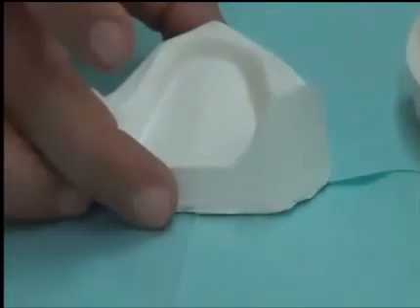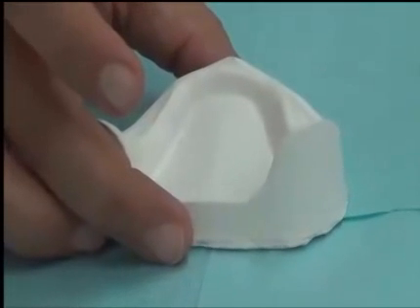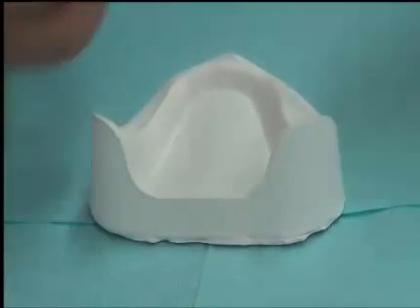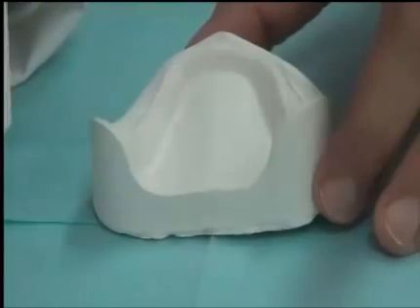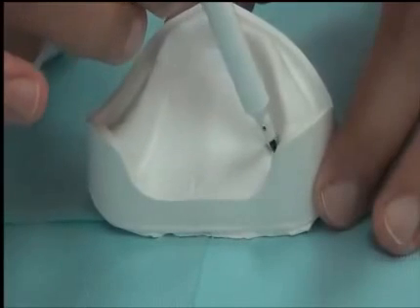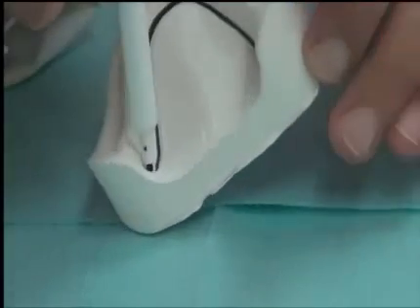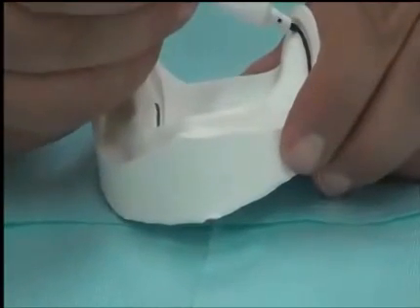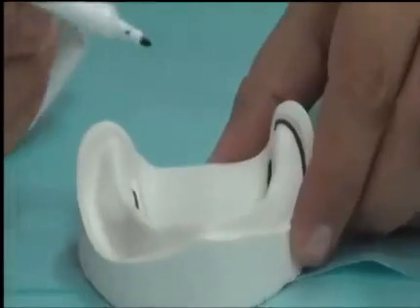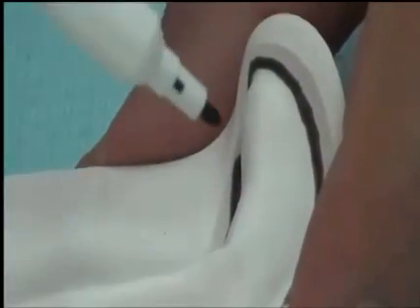For the lower, we are going to follow the perforation method. So for the perforation method, we are going to repeat the drawing of the sulcus. So once more, we put our pen vertically, or pencil if you have colored pencil in your case. So just let it run through the deepest areas of the cast. In the posterior area, we should cover inside the tray the whole of the retromolar pad. In the impression we include it all together. All of the retromolar pad is in there.